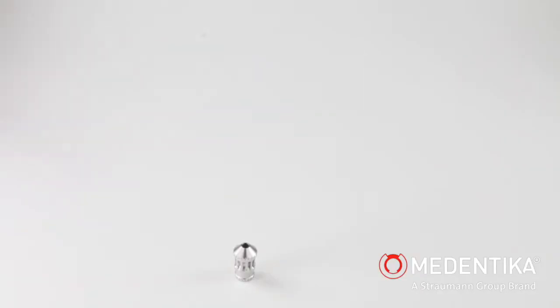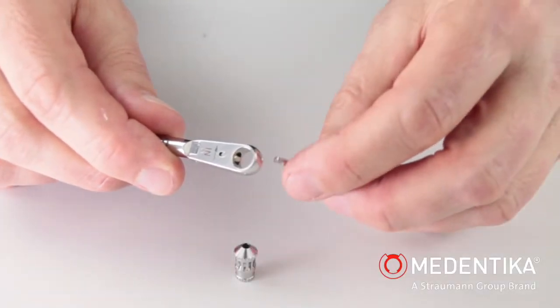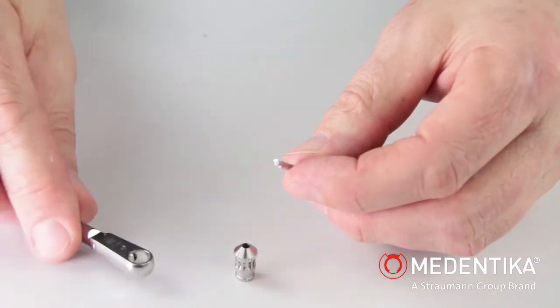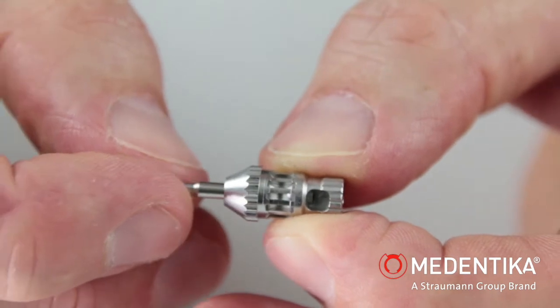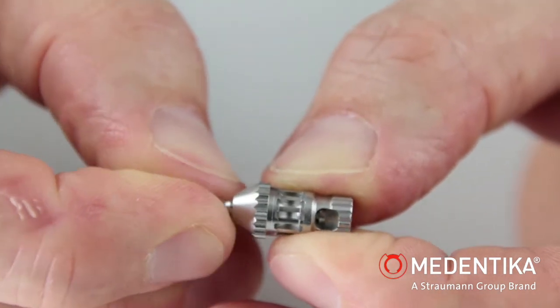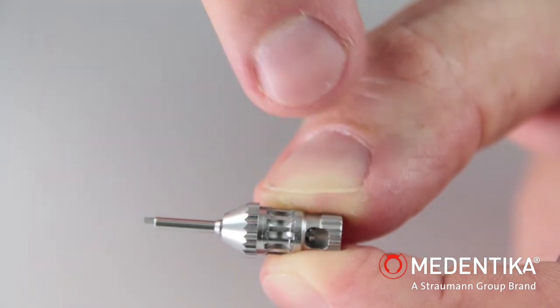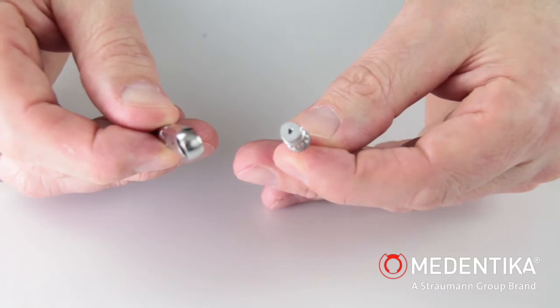The M12 torque ratchet is also converted for ISO shank instruments using the M14 adapter. The ISO shank is inserted in the adapter. A recess at the rear end of the adapter allows the correct fit of the instrument to be checked. The adapter is fitted in the ratchet head.